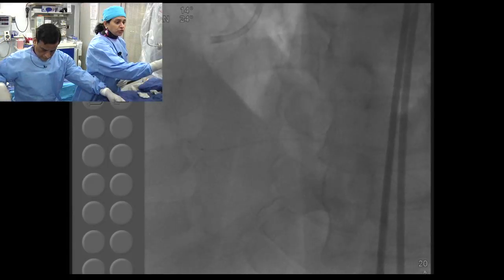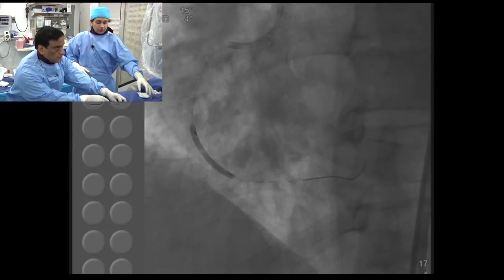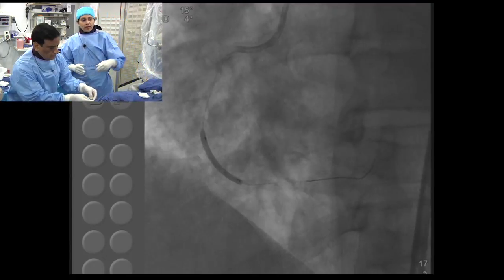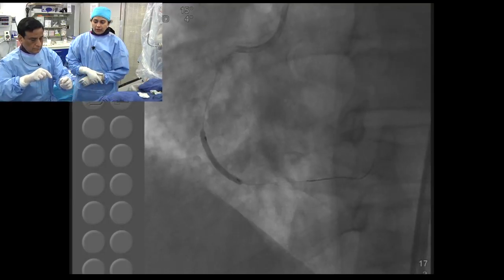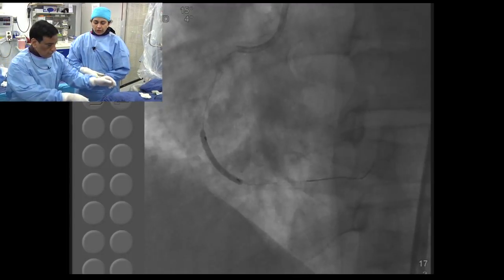So I think how can we do retrograde faster? Just to go over the steps is the same. First and foremost is the decision when you want to do retrograde, and the key could be like this case selection. When we knew that with the multiple bridge collaterals, maybe you go retrograde to begin with. Selecting the septal, the teaching is the same.